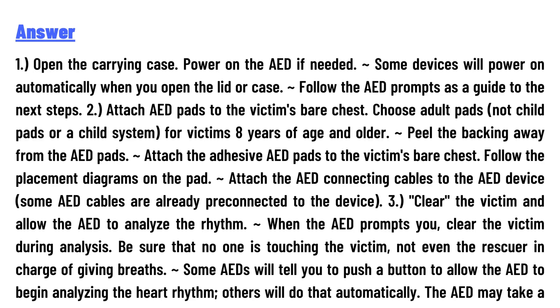Attach the AED connecting cables to the AED device. Note that some AED cables are already pre-connected to the device. Step 3: Clear the victim and allow the AED to analyze the rhythm when the AED prompts you.